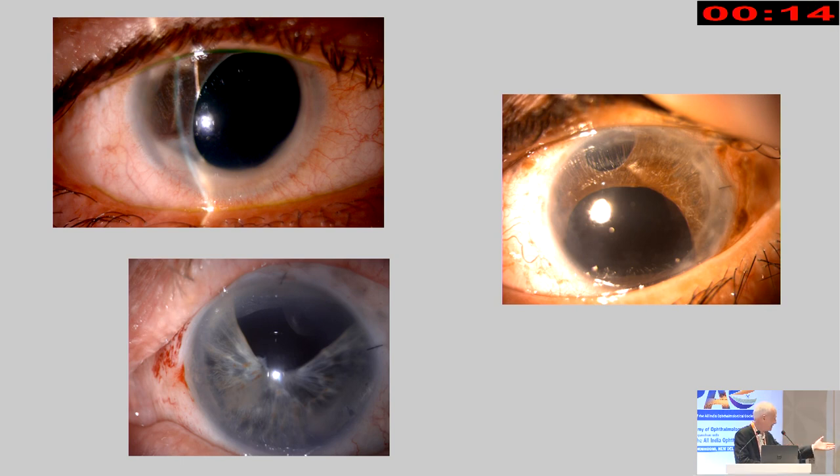We were talking about this last night, weren't we, Nicholas? And I think that's going to be the way to go, is just taking a cornea, taking the cells from it, injecting them, posturing the patient. And in these kind of technically difficult cases, like the unicameral eyes, the eyes with an irregular posterior surface, I think it's going to change everything. So for now, though, this is useful. Thanks. So I'll leave it there.